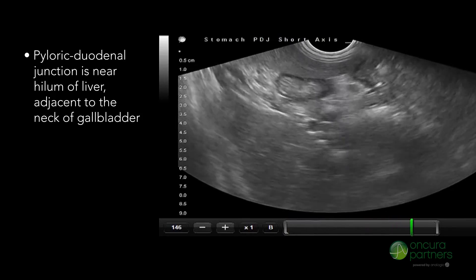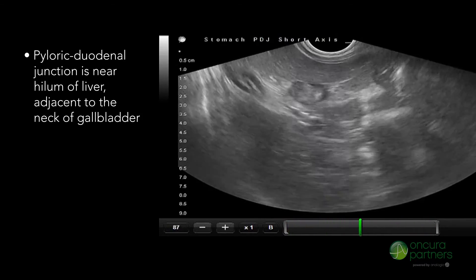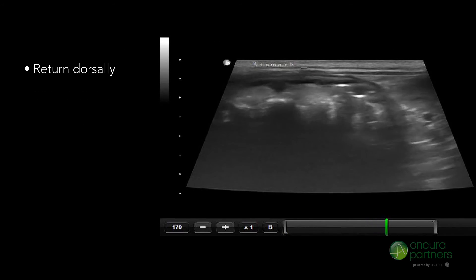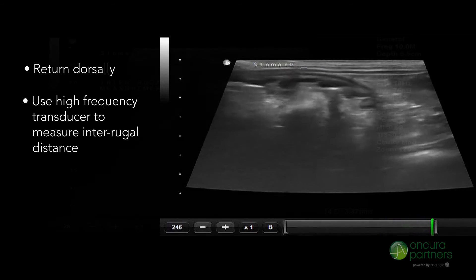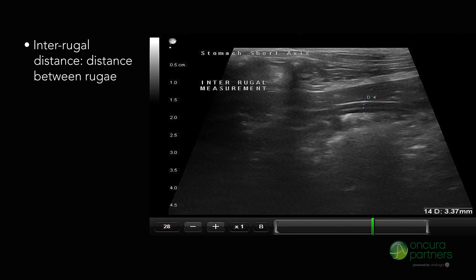The pyloric-duodenal junction is near the hilum of the liver, adjacent to the neck of the gallbladder. Return dorsally and use the high-frequency transducer to measure the interrugal distance. The interrugal distance is the space between the rugae.